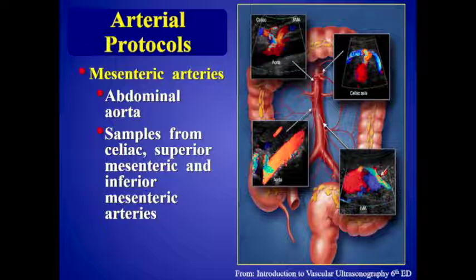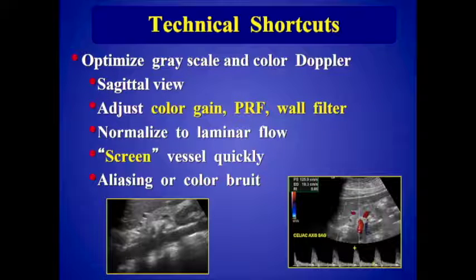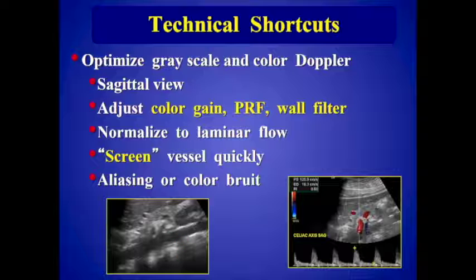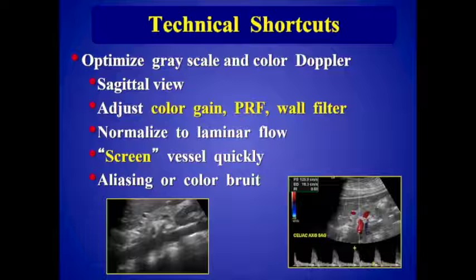As part of our protocol, we start with an evaluation of the abdominal aorta, looking for aneurysm and plaque stenosis, then take samples from the celiac, superior mesenteric, and inferior mesenteric arteries. We want to optimize both the grayscale and the color Doppler, looking for evidence of plaque on a sagittal view. We turn the color on to look for vessel patency and evidence of stenosis or thrombosis. We adjust the color gain, pulse repetition frequency, and wall filter to normalize to laminar flow — in a normal vessel we see a nice, homogeneous color flow pattern with no disturbed flow or aliasing.